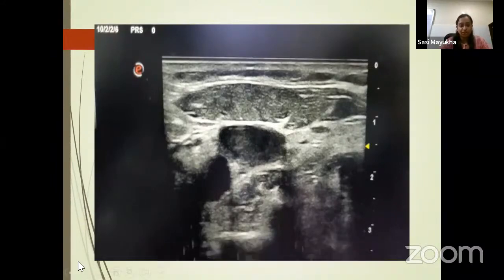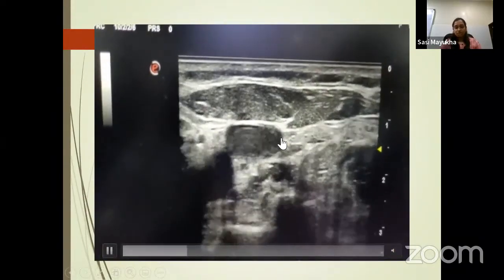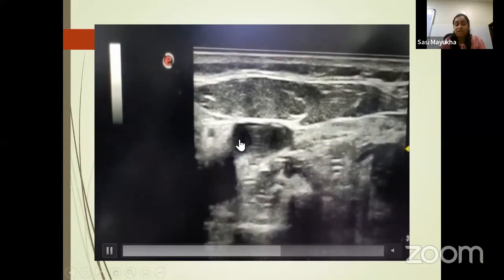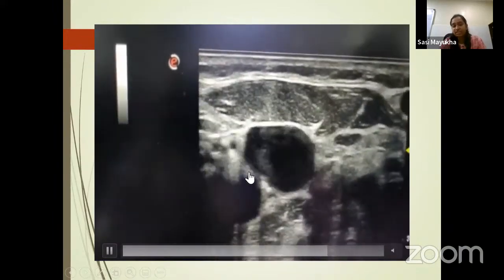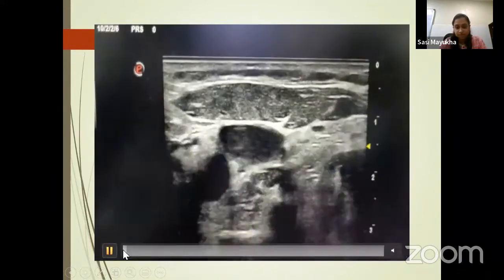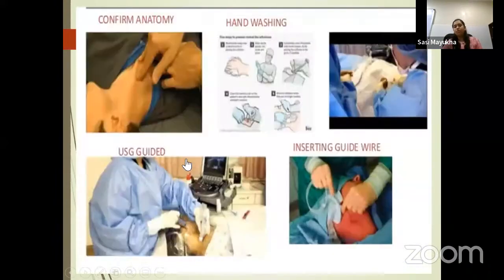This is a small video to show that you can see a thrombus over there. So here you can see a lot of echogenic structures, the thrombus. This is a patient who had a catheter placed multiple times for dialysis because a fistula could not be done. You can see the echogenic structures moving around. So always remember, before doing any ultrasound cannulation, screen the vein and see if there are any echogenic structures, or if it is compressible.